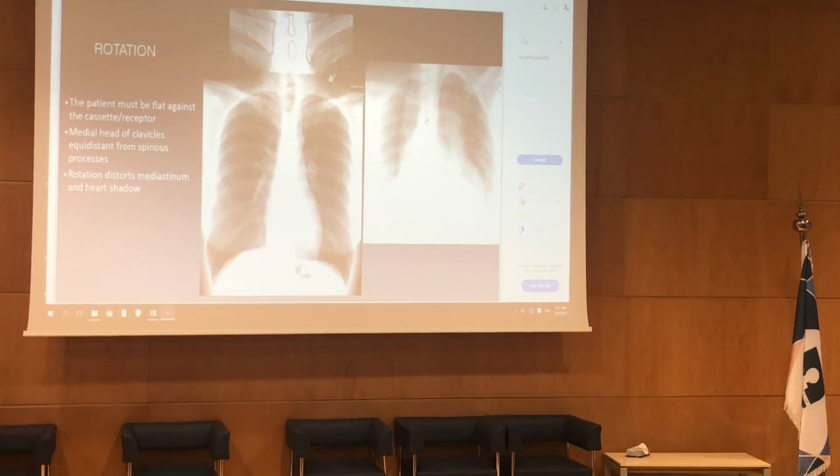So they check their images before sending them to you to read, the clinician or the radiologist, and they will change it. They will take another one. Sometimes the patient is bedridden or comatose, and then they will need the help of a nurse or a companion. They put on their lead apron and they make sure that the patient is stabilized in place, head in place, not rotated.